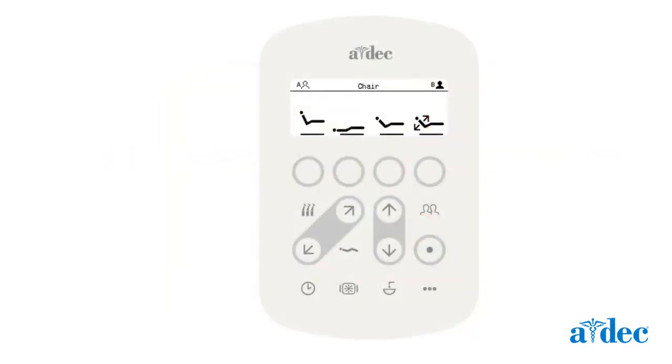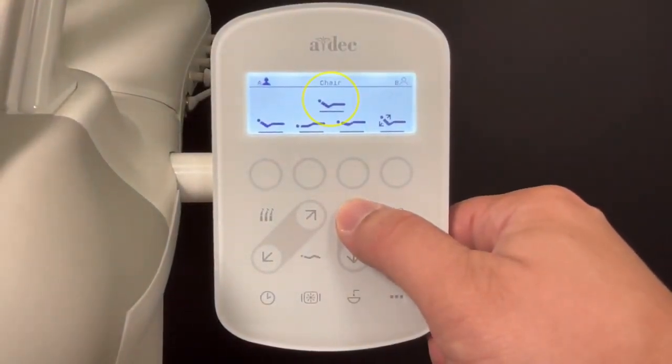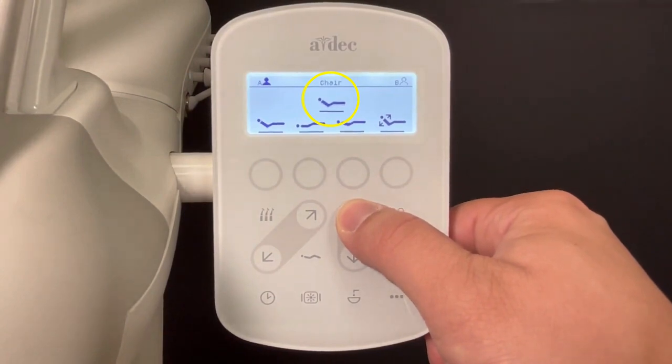In the chair function mode, the diagonal arrows tilt the chair back either up or down, while the vertical arrows raise or lower the chair base. This demonstrates the base buttons in use. Notice that the chair icon moves to show the chair's current position.